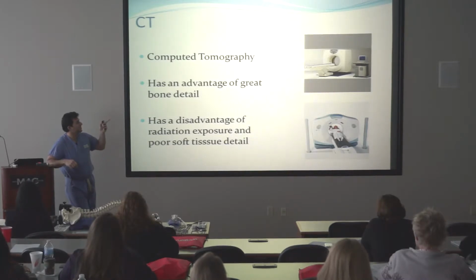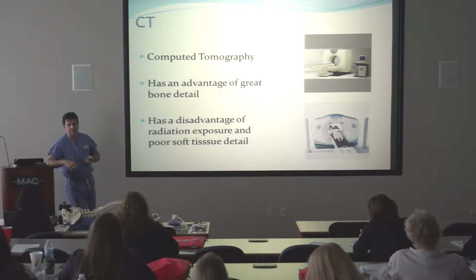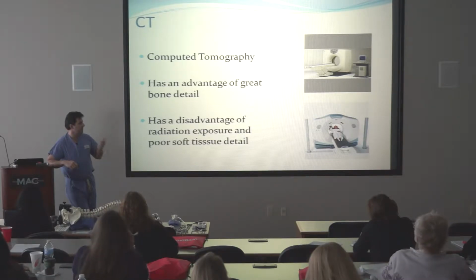So CT stands for computed tomography. It's an advantage. It has great bone detail, okay? Disadvantage is that it's a lot of radiation, actually. It's like 100 X-rays at once because of the way that the CT scan works.